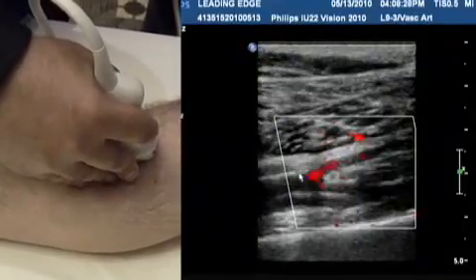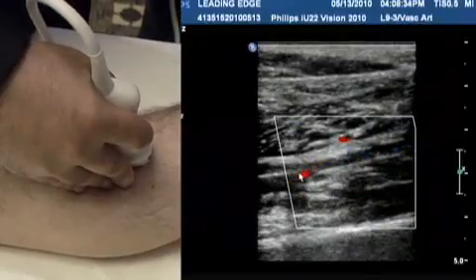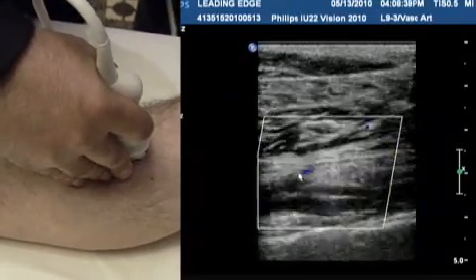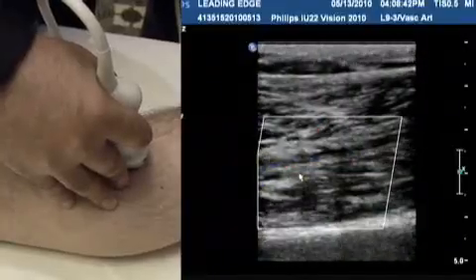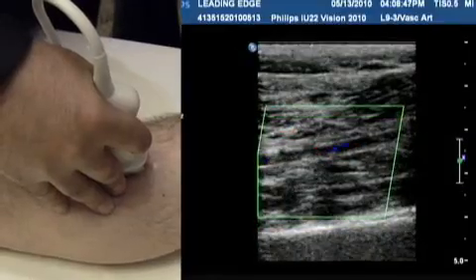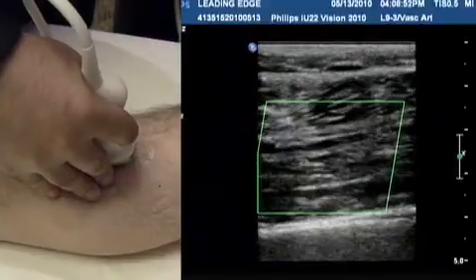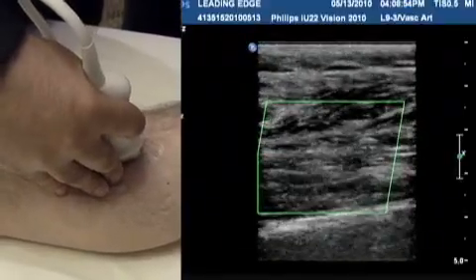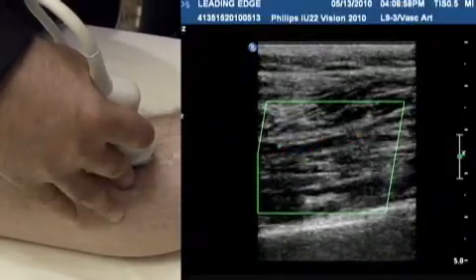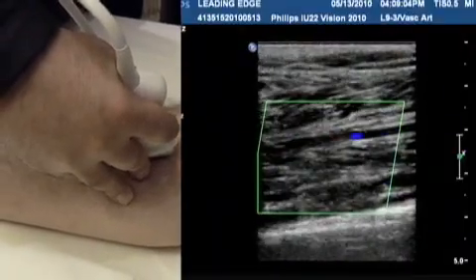artery. So why don't we follow the posterior tibial using the color flow image. Again, color, as you can see, is a very important aspect of this test, which really is an anatomic study more than it is anything else. Although we use all the tools in the toolbox to help us make our diagnoses, we use the color, we use the spectrum, we use a 2D image. Really what we're trying to do is put together a map that the interventionalist or the vascular surgeon can use in order to determine what type of intervention would be best in a given patient.